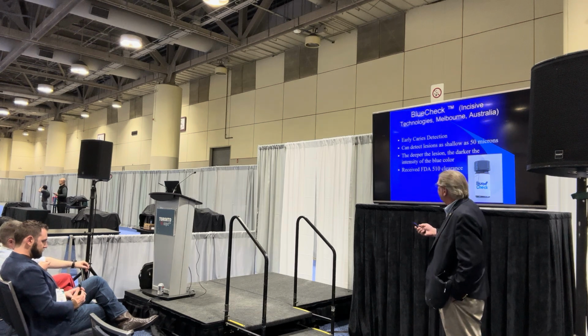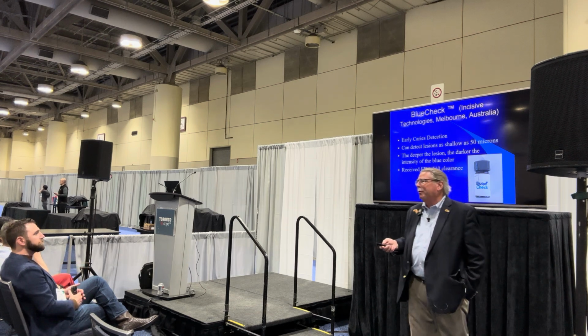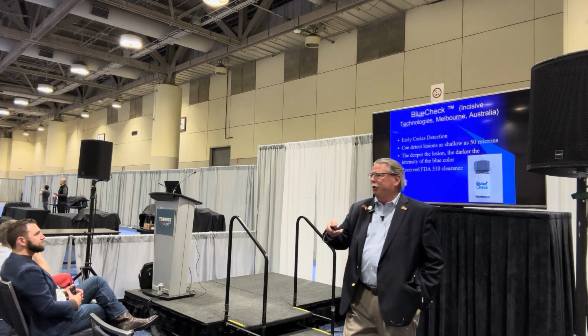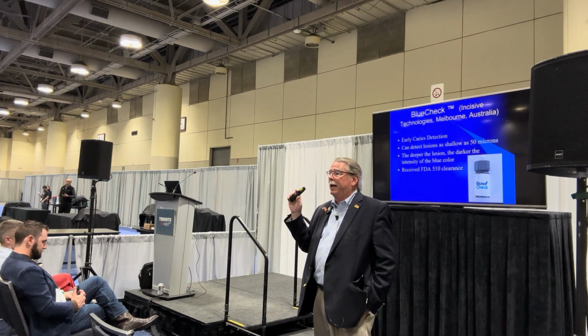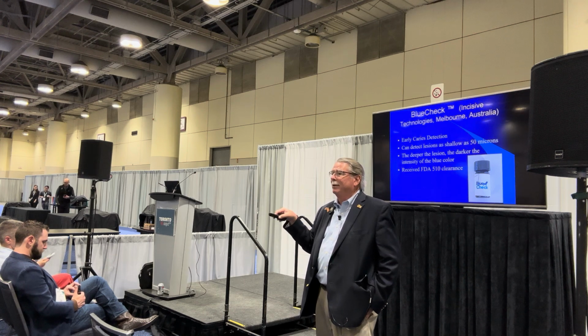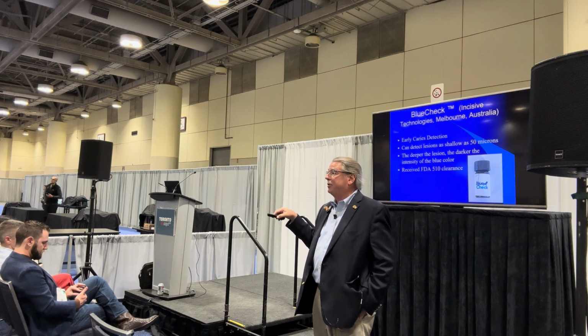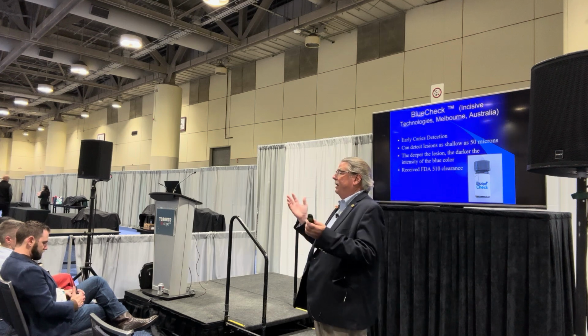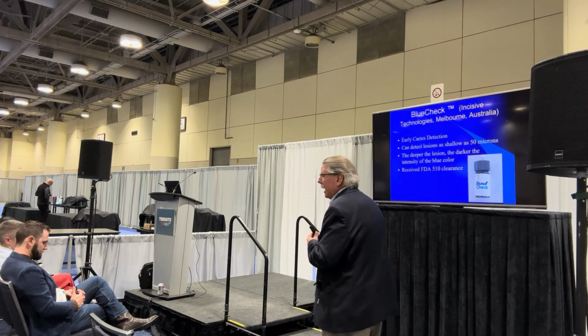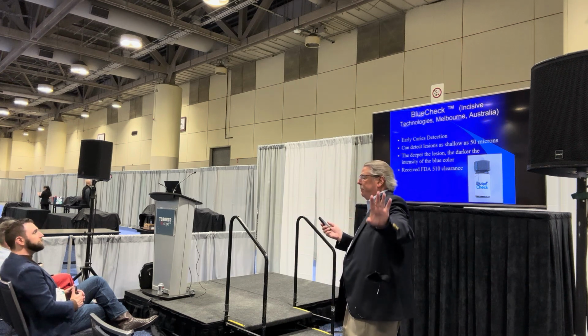And more intense the color is. But what made it critical for me to be talking to you today is that it didn't have FDA approval until just recently, and now it's marketed within the United States. So this is kind of a primo time to talk about it because it just started getting sold several months ago in the United States. It's been in Australia for many years.